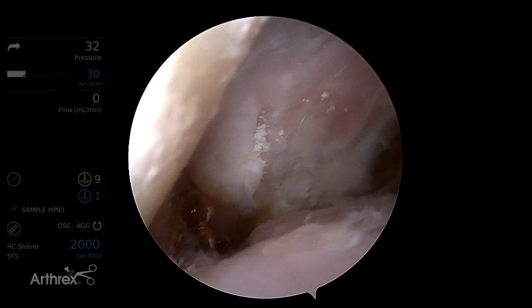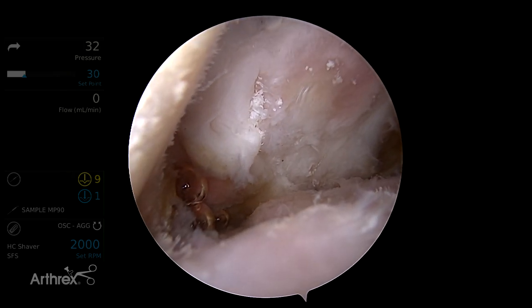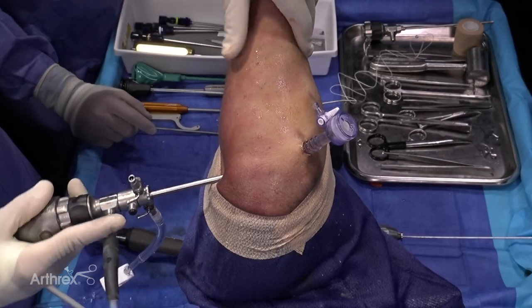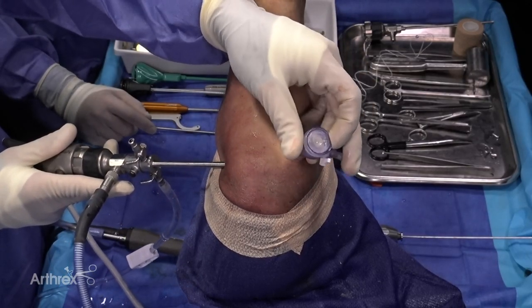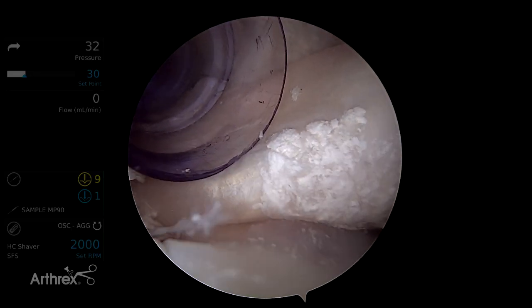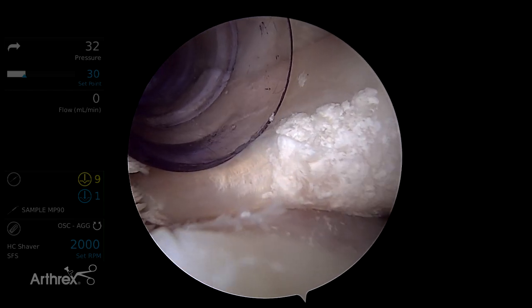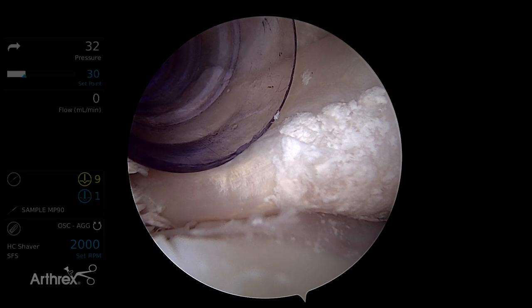Looking anteriorly, we have simulated an upper subscapularis tear. You can see disruption over to the bicipital groove. This is a full thickness tear of the upper subscap — a type 2 LaFosse tear, which in my mind is amenable to a double row repair because it extends over laterally. But we have a limited footprint to work with, so I'm going to show you a relatively bone-preserving technique.